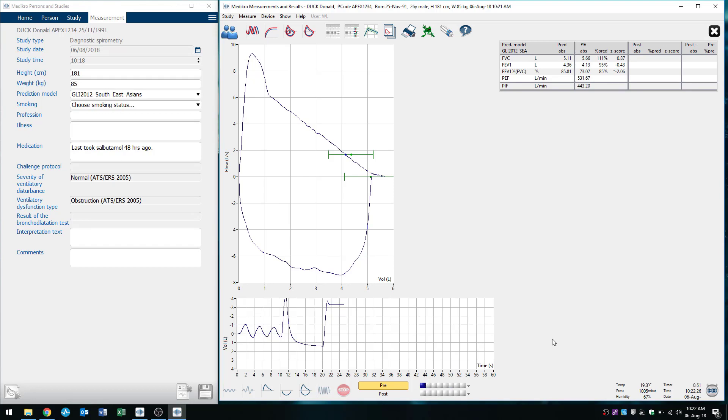Of course, for spirometry, a minimum of three blows of which two need to be acceptable and repeatable according to the ATS ERS criteria. So we'll just do one more of those.